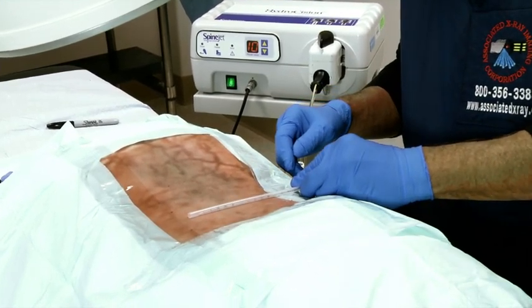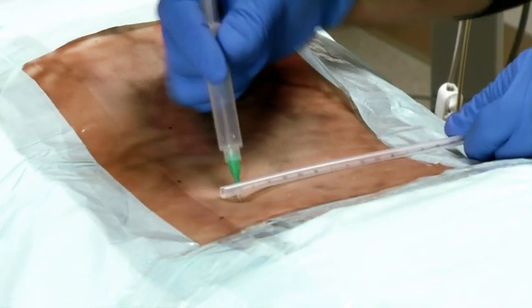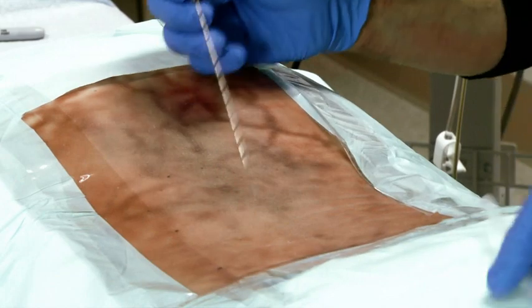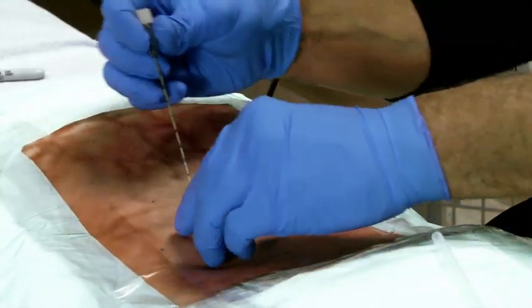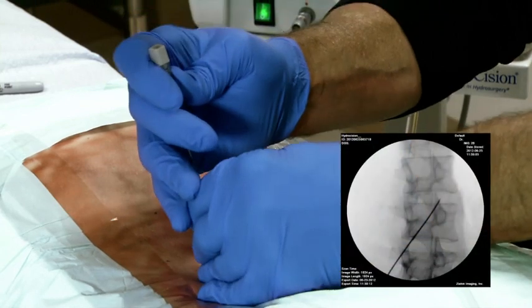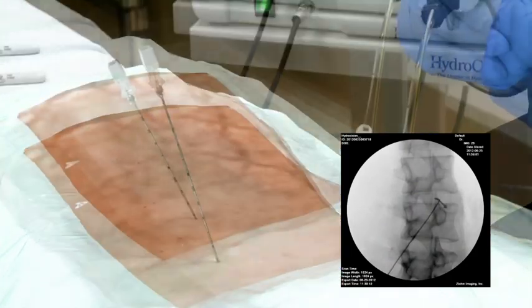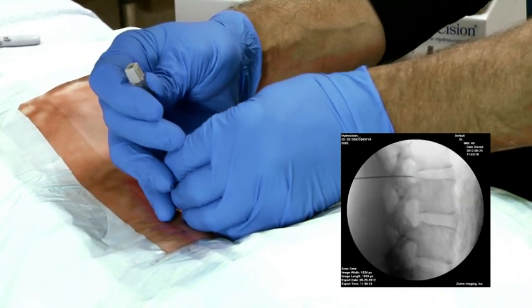The more lateral the herniation, the less oblique the angle. Once this setup is complete, you will administer a local anesthetic under live fluoroscopic guidance. The tip of the access needle is lined up with the center of the disc and the lateral border of the superior articulating process. Continue to advance the needle just until you feel resistance of the annulus. The patient could feel pain if the needle is too close to the nerve. Confirm the depth of the needle, which should be no further than the medial border of the pedicle.